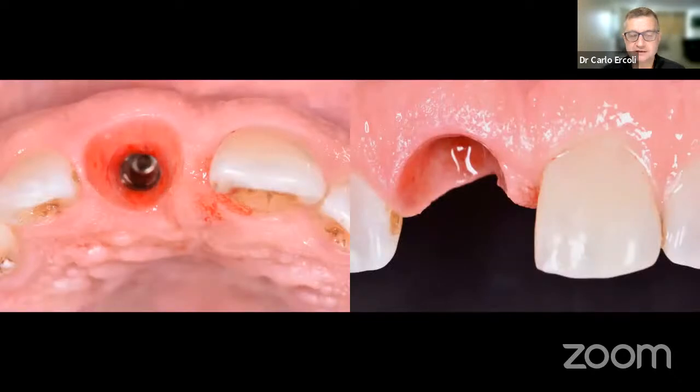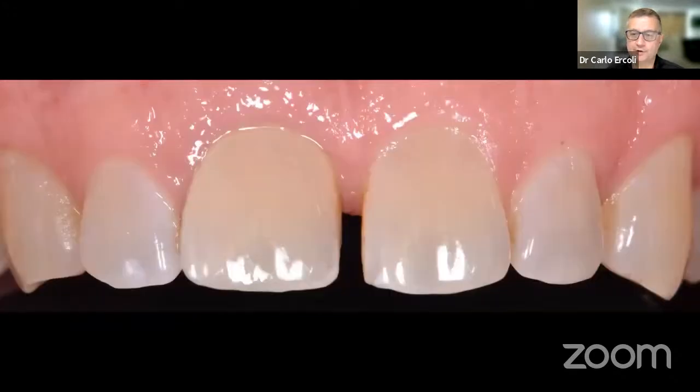But now, as you take that crown off, you say, well, do I have a chance to perhaps mold that tissue, push it a little bit towards the mesial so that it will go further down and fill in a little more of the interproximal space? And the answer is really no, because you do not have that contact point. You might have the bone, but you do not have the contact point. And again, here you see the patient tried to ask me to make a little wider crown, but certainly that was not the way to go.